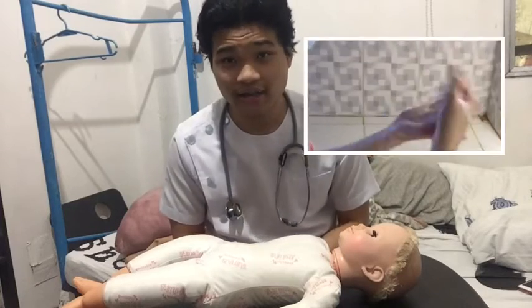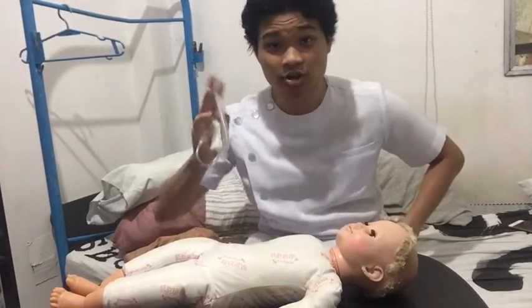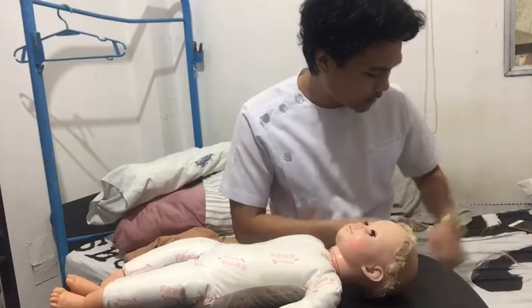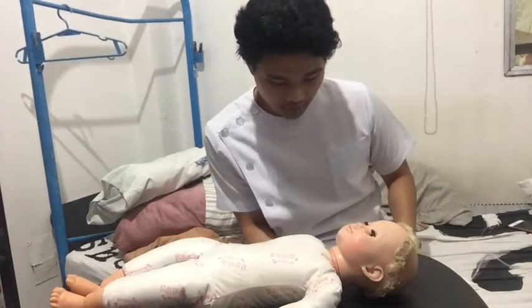What we're going to first be doing is we're going to be washing our hands. After washing our hands, we're going to be getting the oxygen cannula that we're going to be using. And we're going to be attaching this to the oxygen tank. And we're going to be adjusting the oxygen tank to the desired flow rate for the client.